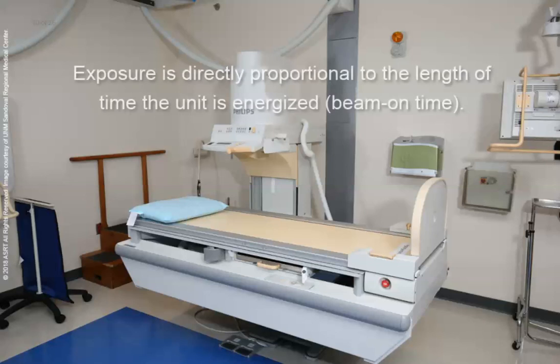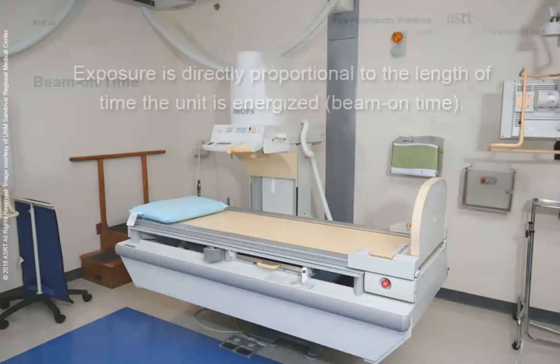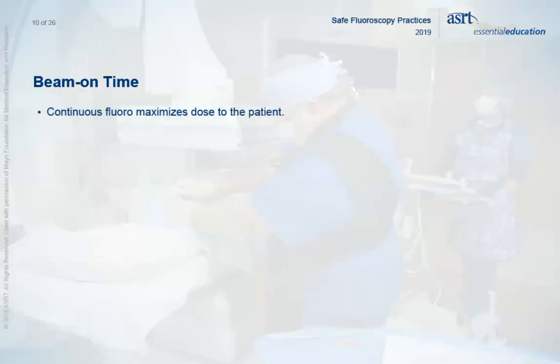During fluoroscopy, radiation exposure is directly proportional to the length of time the unit is energized, called the beam on time. Increasing the period of time the X-ray unit is on increases radiation exposure. Fluoroscopy units do not contain a fail-safe switch or automatic timer to terminate exposure like regular X-ray units do. Therefore, favorable clinical outcomes hinge on the careful use of fluoroscopy time and good judgment to balance image quality and patient dose. Continuous use of fluoroscopy maximizes the radiation dose to the patient. If the operator uses fluoroscopy intermittently and for the shortest time needed to make the required observations, the patient's total radiation dose will be lower.